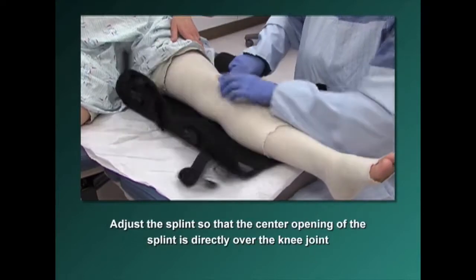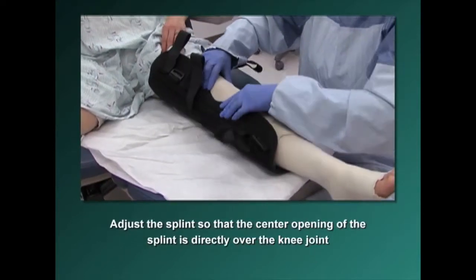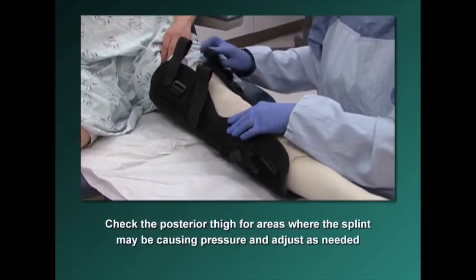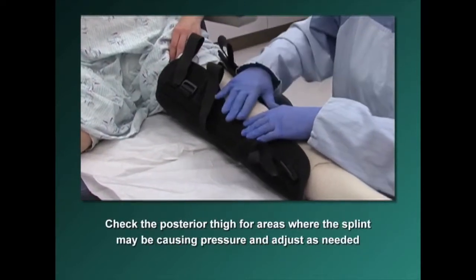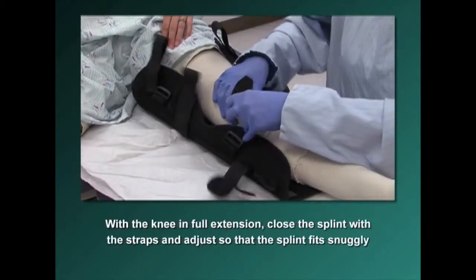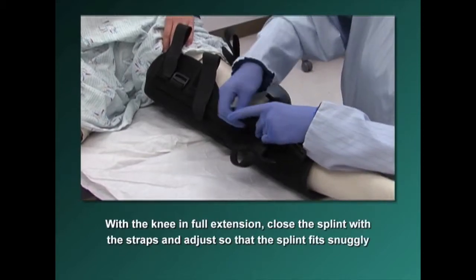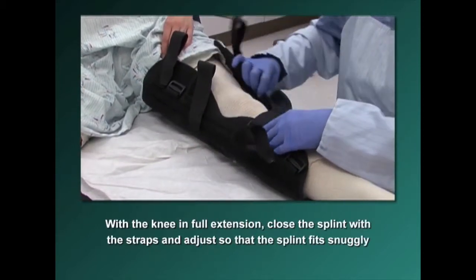Adjust the splint so that the center opening is directly over the knee joint. Check the posterior thigh for areas where the splint may be causing pressure and adjust as needed. With the knee in full extension, close the splint with the straps and adjust so that the splint fits snugly to the leg.